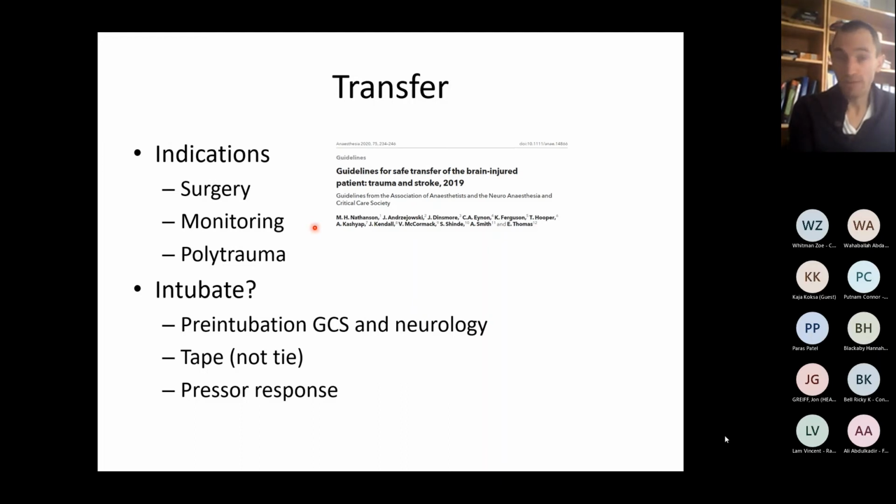The other monitoring intervention that can be done at Queen's is to put in a bolt. So a bolt is a hole that's drilled in the skull, and a pressure transducer is put through that, sits in the brain parenchyma, and gives a direct reading of the pressure oscillations within the brain. That gives a reading of ICP. So when I've talked about trying to ensure that patients sit up to reduce ICP, or that the MAP's adequate, using these interventions really allows us to see exactly what the ICP is, exactly how well we're perfusing that brain. So some centres have monitoring that we just don't have access to here.